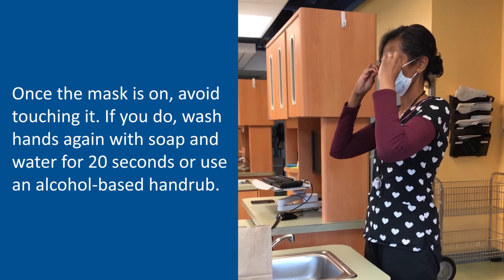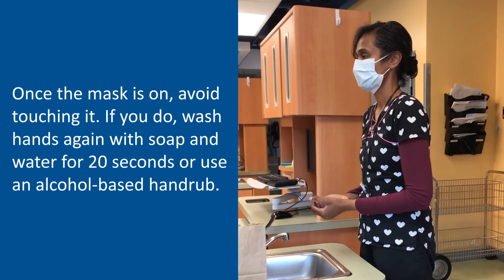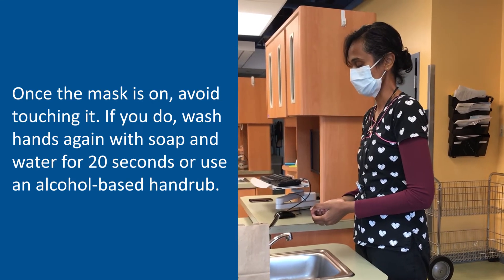Now that you have your mask on, avoid touching it. If you do touch it, clean your hands again with an alcohol-based hand rub or wash with soap and water for 20 seconds.